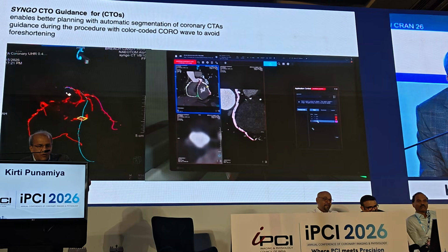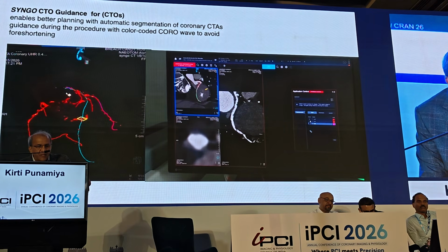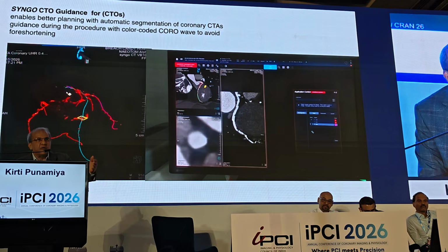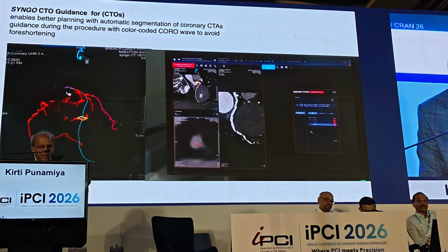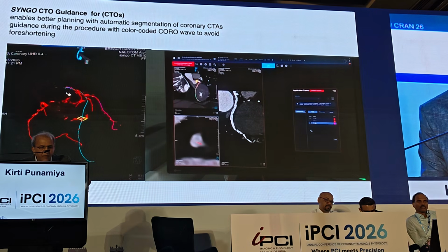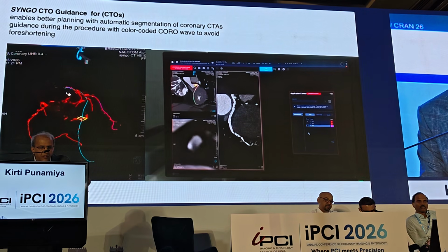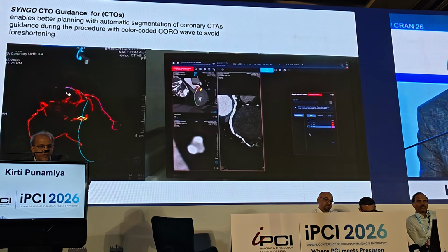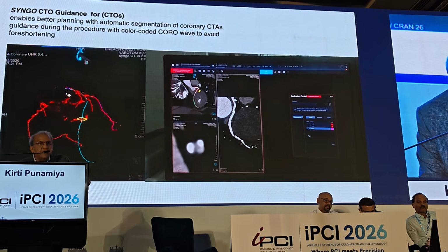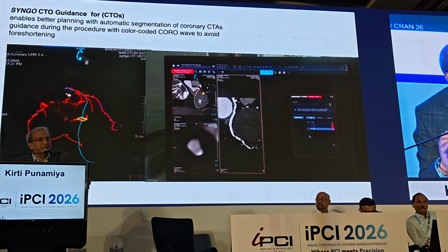Can you see this cross section now? And you can see your calcium, and the bloom allows you not to see the true lumen, but you can adjust that bloom. You can cut it or store it, and then you can see the lumen here, and you are mapping the true lumen. Can you see you're mapping the true lumen on this longitudinal MIP, and you can see the relationship of those plates, and the lumen is between the 2 calcium plates, as I told you, that you already know the path.